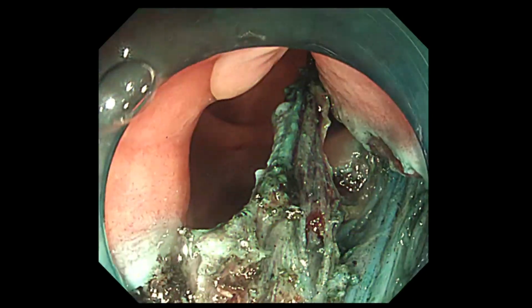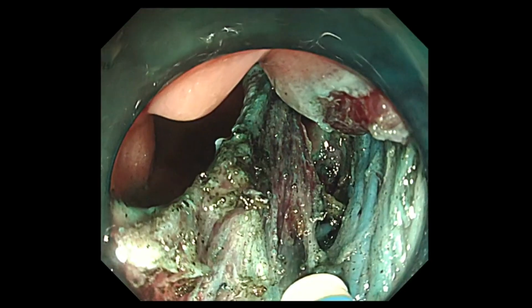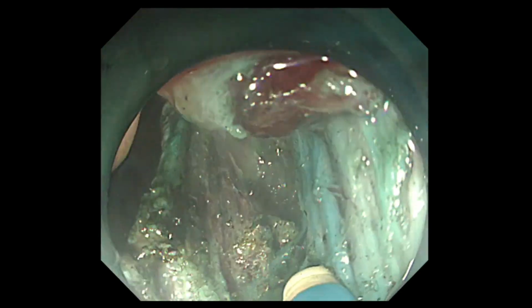This method provides continuous tension for traction of the flap. Then we can perform the en bloc resection easily.